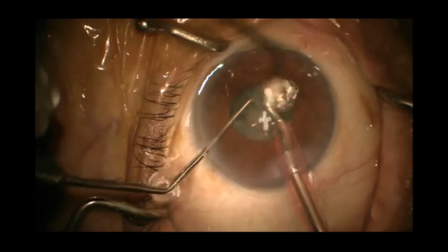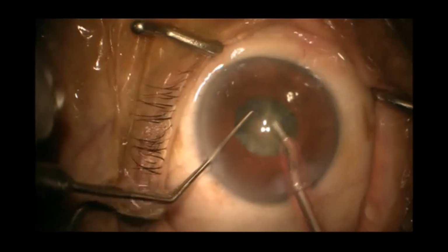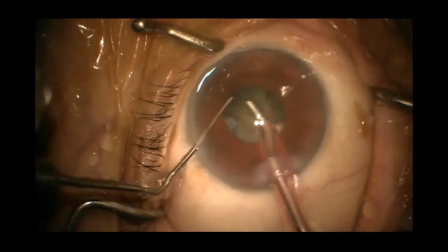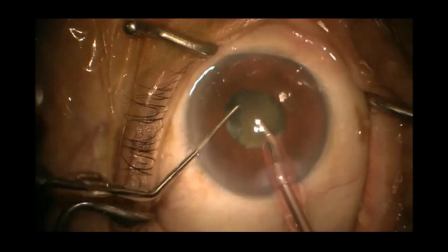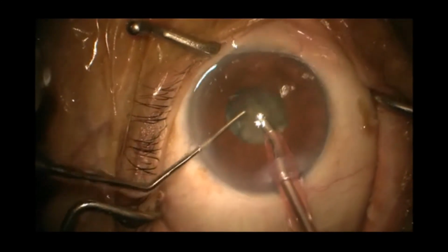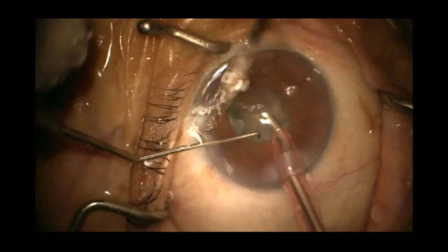I am taking care not to go too much in the periphery with my phaco tip. Don't want to catch any of the iris tissue or capsule. Just bring the nuclear pieces into the center and then phacoemulsify them.